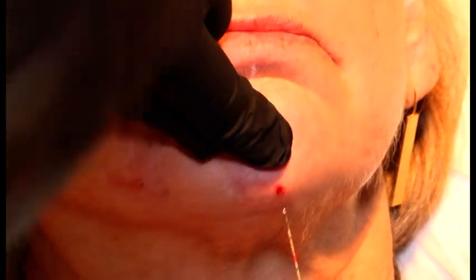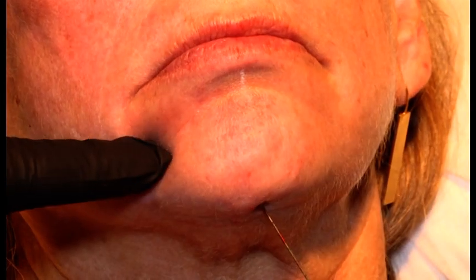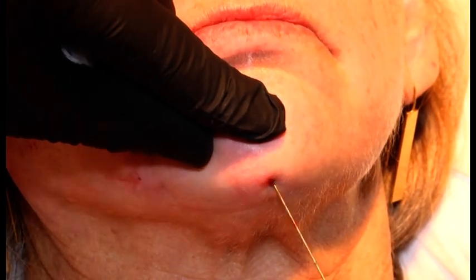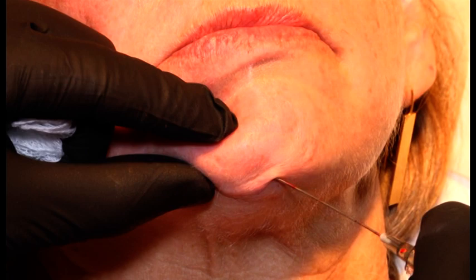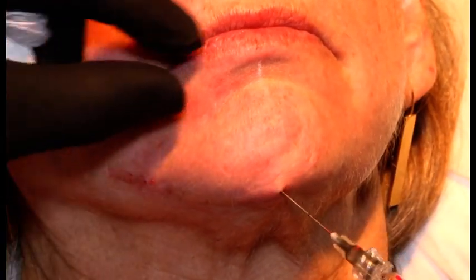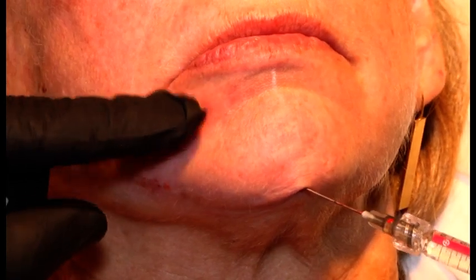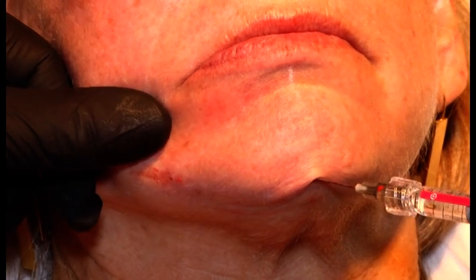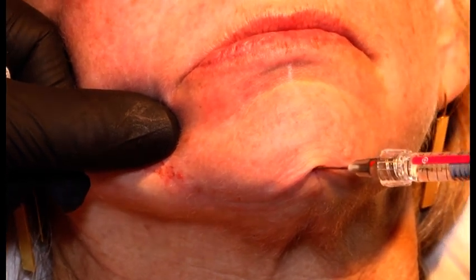So from here, you could also correct bone resorption. You see that she has a little bit of a depression here. And so from here you can go underneath the depressor labii inferioris muscle, right here. But then again, you have to check if the cannula tip is not entering into the mucosa. Check the tip location and inject. And inject a little bit more below the depressor anguli oris, the DAO.